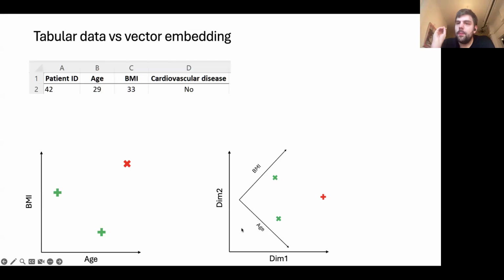First of all, we're just hoping that with self-supervised learning, we end up extracting useful information. And there's also a bit of a no free lunch theorem, in that what information you want to extract from the image depends on what you want to do. In some cases, there's information that you would like to ignore.